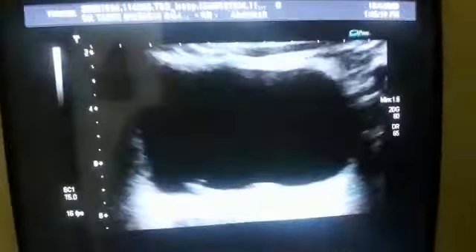Now if you concentrate, there is a breach between these two cysts, and this area is in fact consistent with either a cystic structure relating to the vaginal stump because of a loose stricture when the suture was placed during the removal of the uterus.